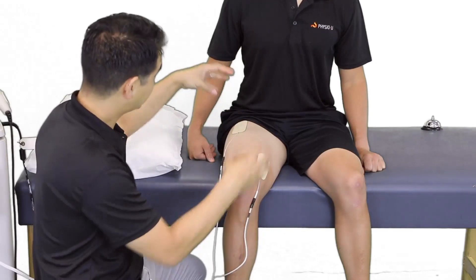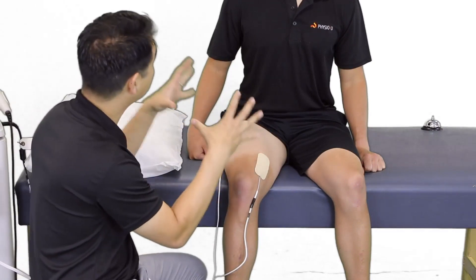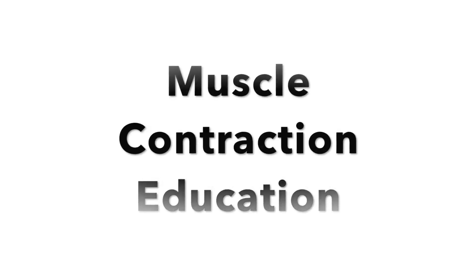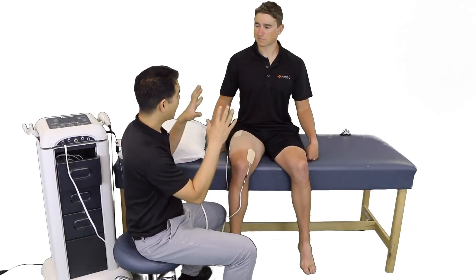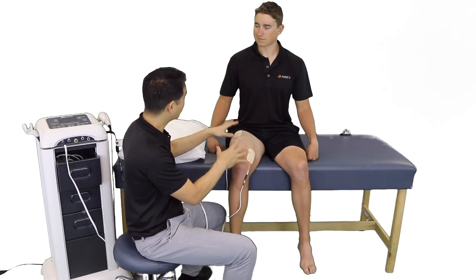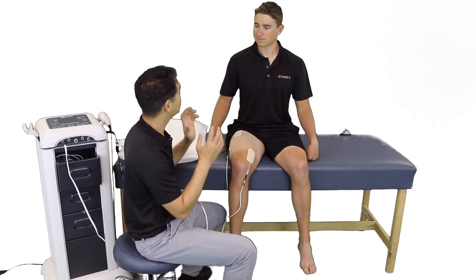Patrick, where you're going to be feeling is the beginning of a tingling. Eventually the muscles will begin to pulse. And what we want is a strong muscle contraction, as strong as you can tolerate. What you're going to start feeling is some tingling as I start the device, then some gentle muscle contractions and eventually a very strong muscle contraction. We are going for muscle strengthening here, so we want as strong a contraction that you can tolerate. It may be a little bit uncomfortable, but it shouldn't be painful.